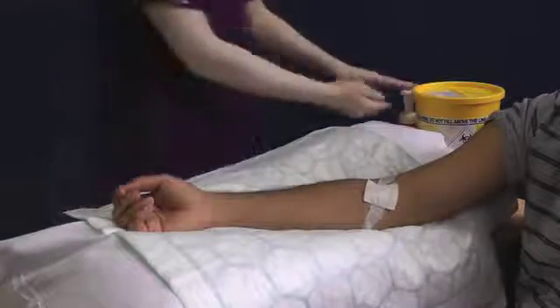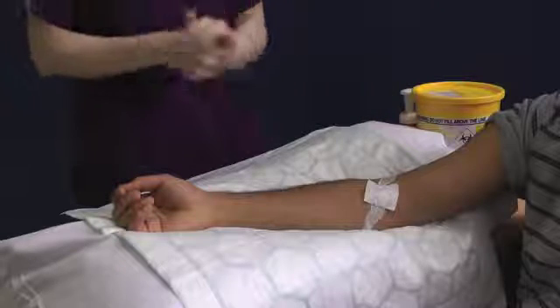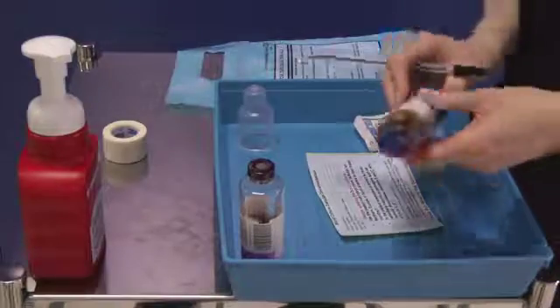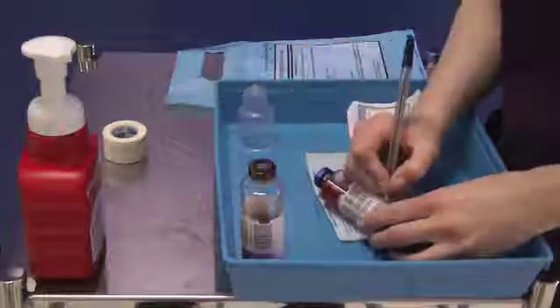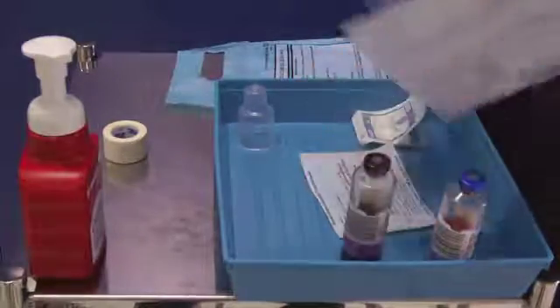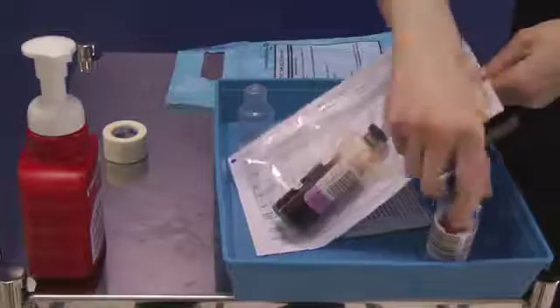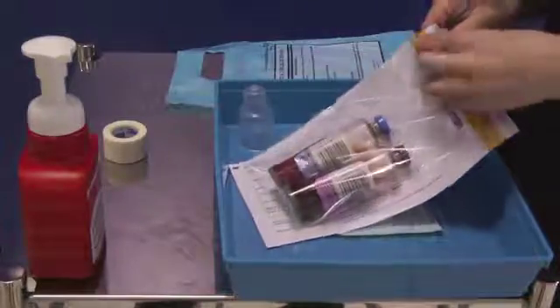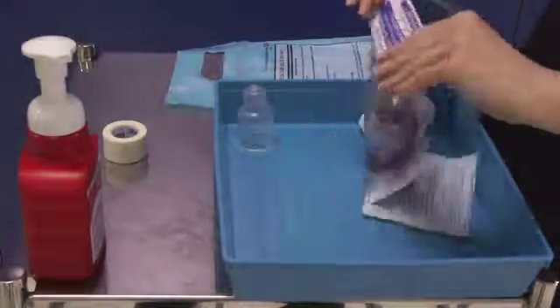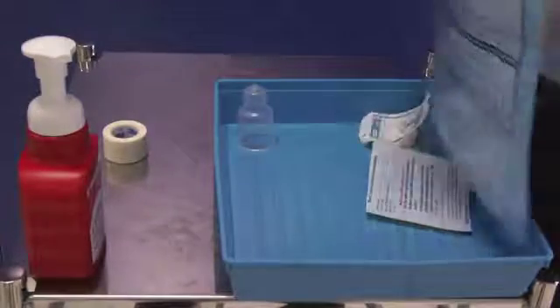Remove your gloves and apron, decontaminate your hands and turn your attention to the blood culture bottles. Label the bottles at the patient's bedside. Place them into the request form bag. Place this into the blue blood culture bag and seal it. A biohazard bag must be used for samples from high-risk patients.